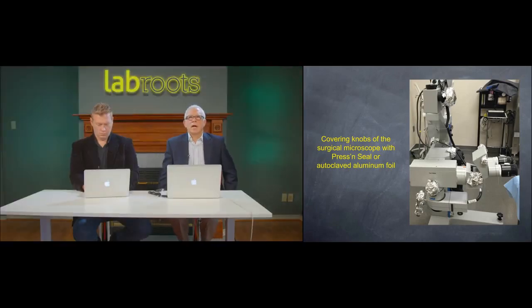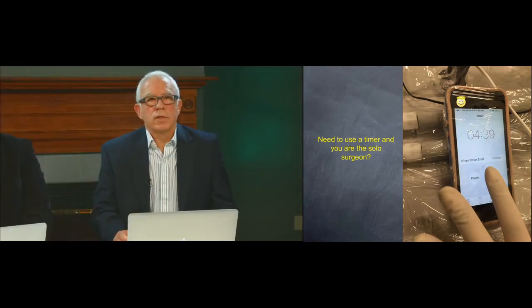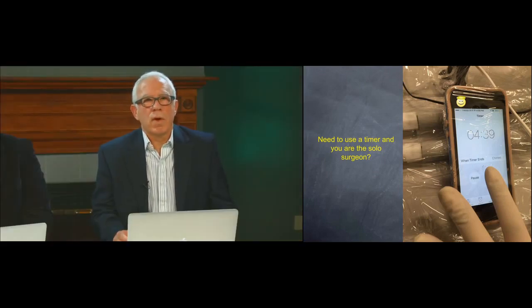And this is when I was evaluating the surgical program. An investigator was having infections at another institution that I will not name. We had to go over all these issues of press and seal and how to maintain sterility. They were not using a sterile field, they were not draping the animal. After we went through this training, I went back to the lab to see how they were doing. In this case they were using Saran wrap or cling wrap, like press and seal.